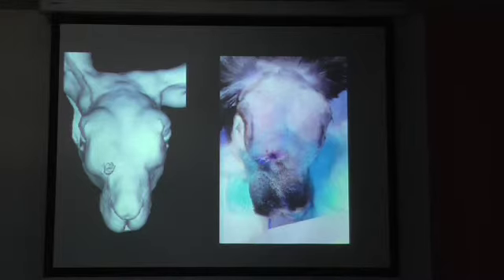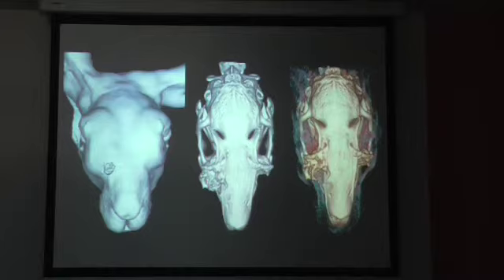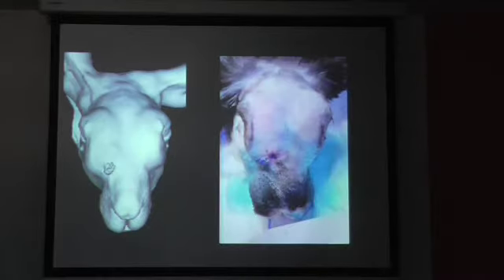So dental radiography in this case is to assess the whole reserve crown, not the spikes.